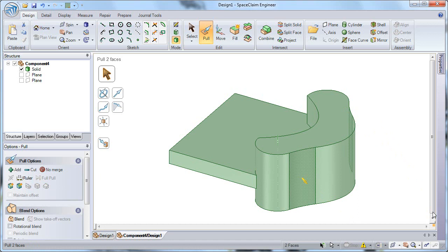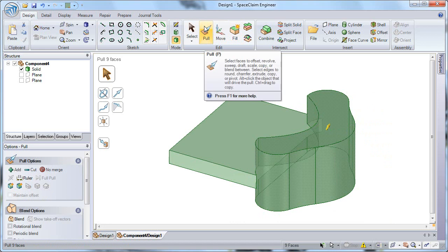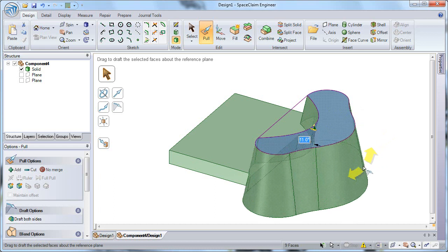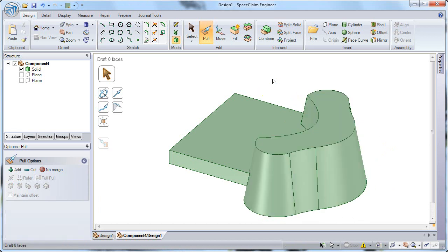And now I want to draft that entire body on the right-hand side as well. So using my Select tool, I have two options of box select. I can do a box select from right to left, which is a partial select and selects anything that's partially in that box, or left to right, which is a full select and will only select any geometry that's fully within that bounding box. So now with all of that geometry selected, I'll pull, select my draft feature from my tool guide, and select the top face to draft about. So I'll draft about that face, specify a specific draft angle of 10 degrees, and complete that feature.